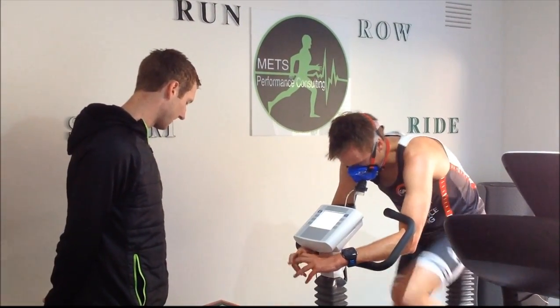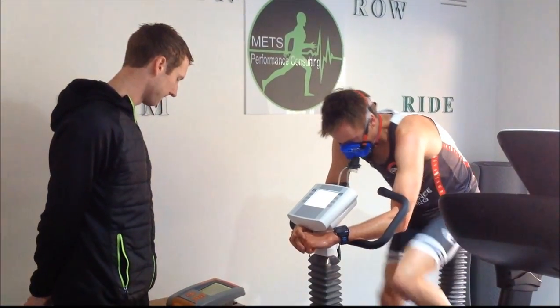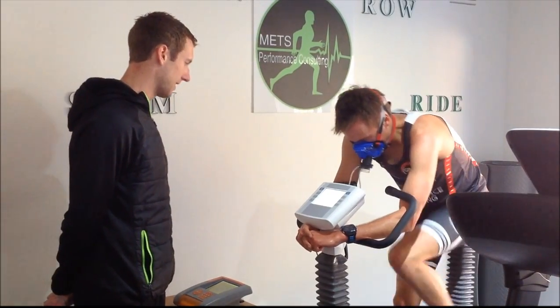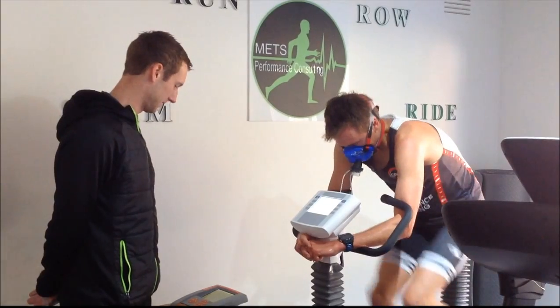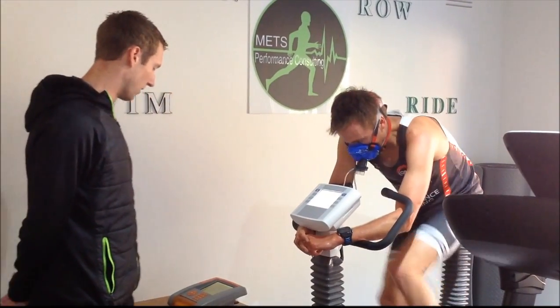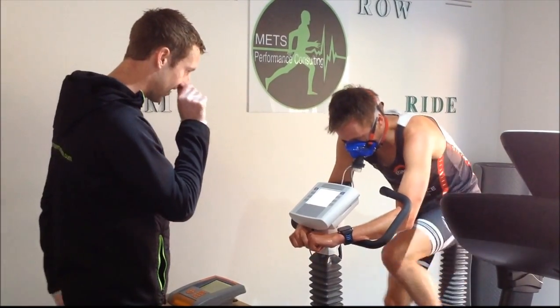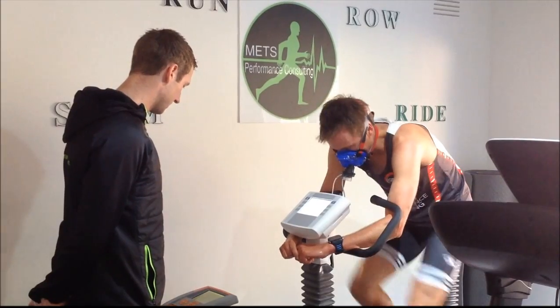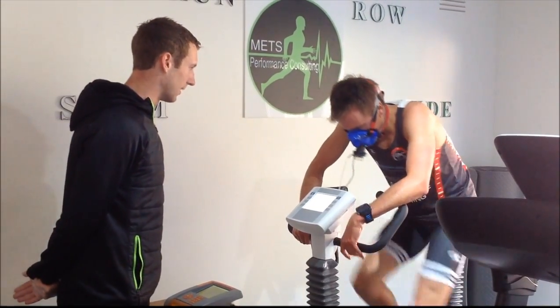We've got 76 now. 15 seconds at this time. 30 seconds left at this stage, you got it, come on. Keep pushing mate, you'll keep going. 15 seconds left, we're up to 375 after that, come on. Look at the rate, as hard as you can. Everything you've got. 76.5.